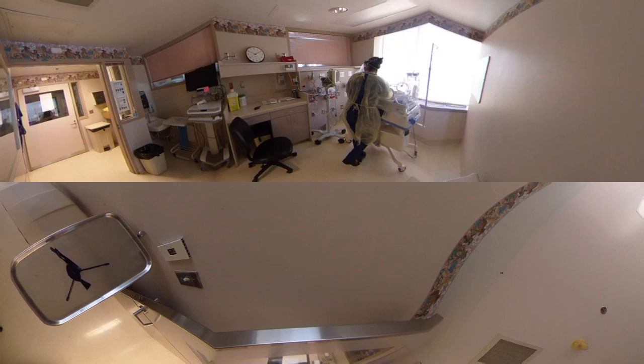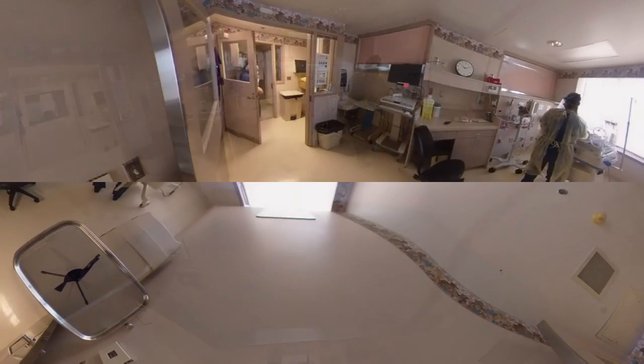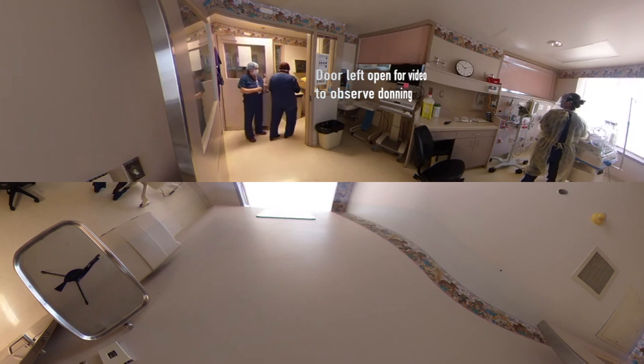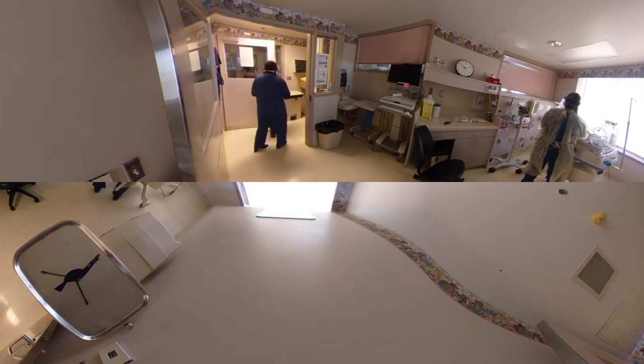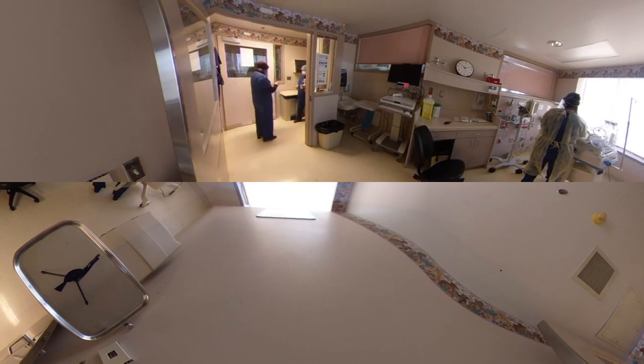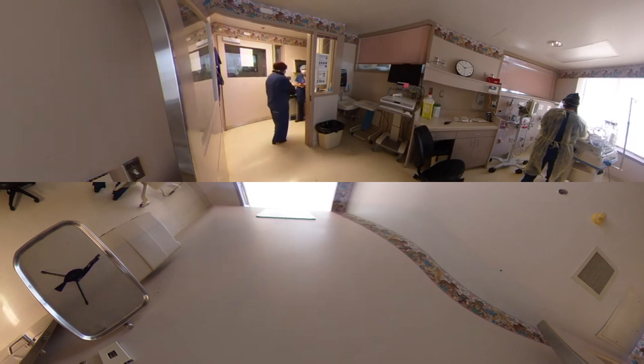I'm bagging and the heart rate is coming up. So Nadia, I'm going to talk you through donning because you need to go in the airborne room. First of all, I need you to perform hand hygiene. Actually, remove your jewelry and lanyards first. Now hand hygiene — 20 seconds of hand hygiene.